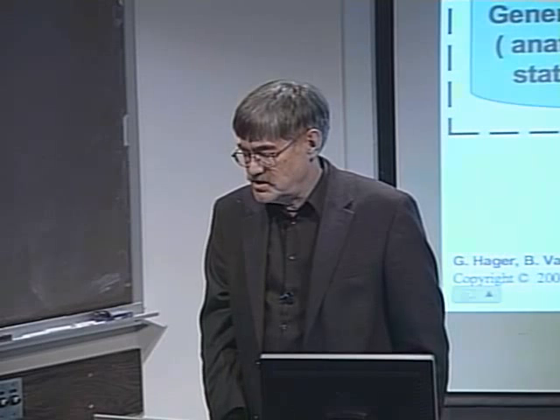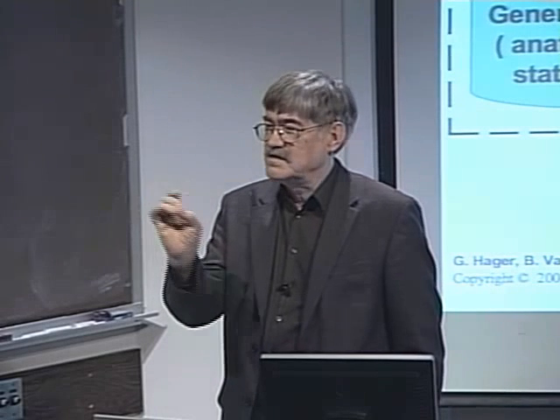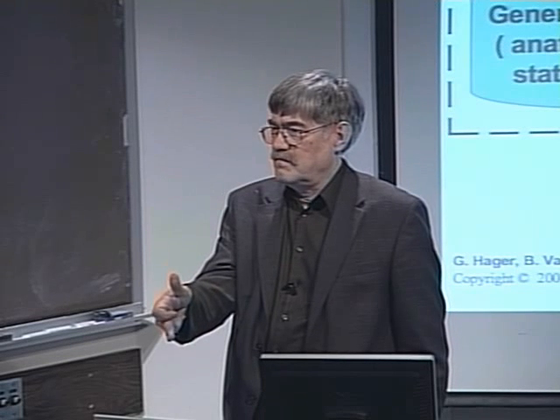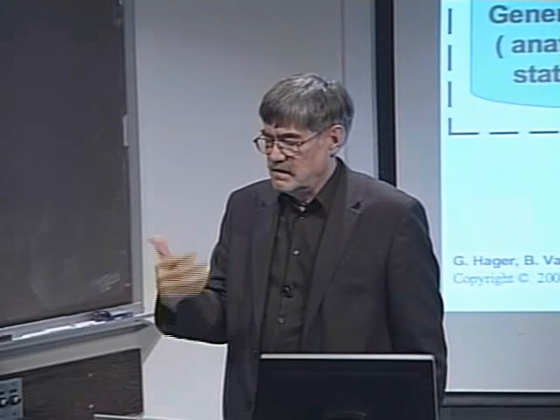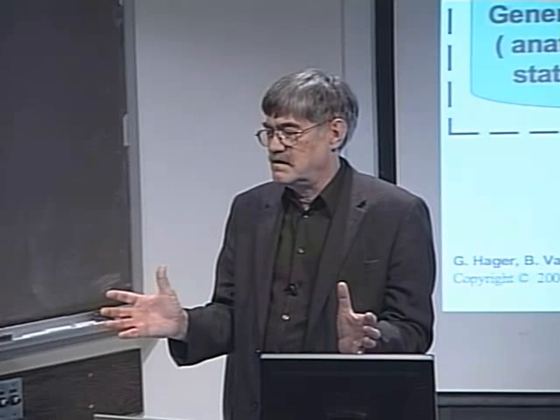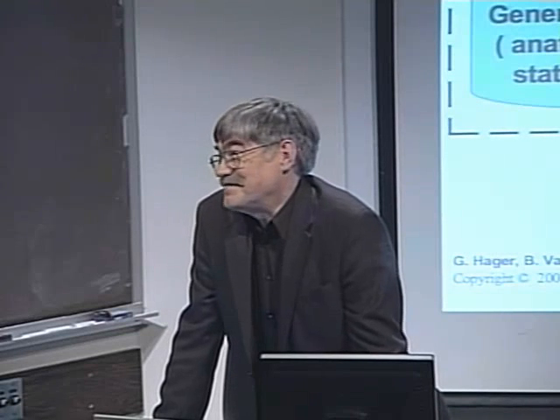In fact, I should mention that Dr. Hager and Dr. Riviere have an NIH grant in which the idea is to use real-time vision as feedback to help stabilize that handheld instrument against a feature. And Cam, Greg, and me, and some eye surgeons are hoping to get some NIH funding to take that whole idea to the next stage, to make a really smart assistance system for retinal surgery. We have some pending proposals that we hope are funded. If not, we'll have to find some other way to do it.